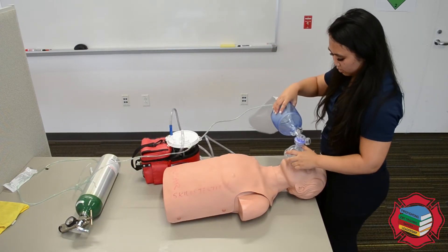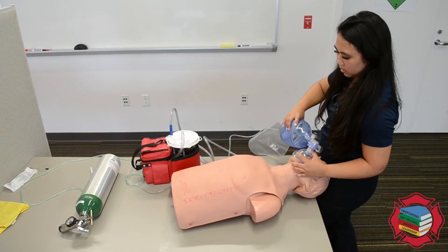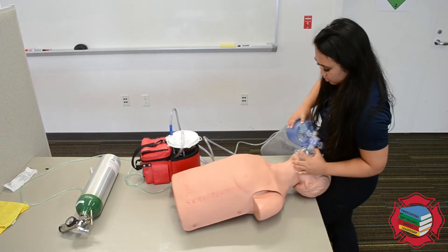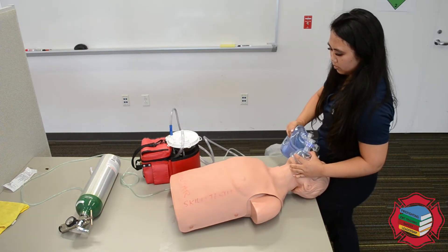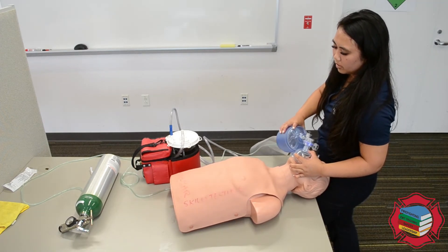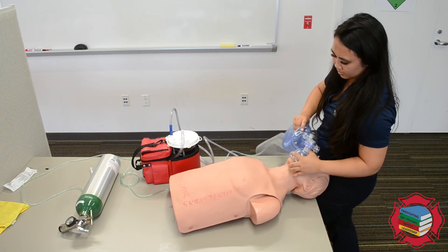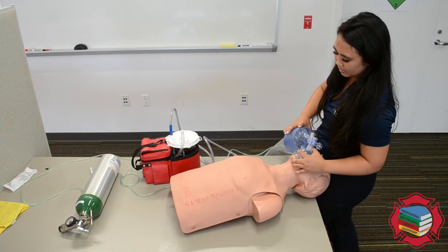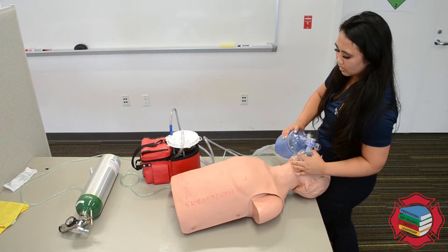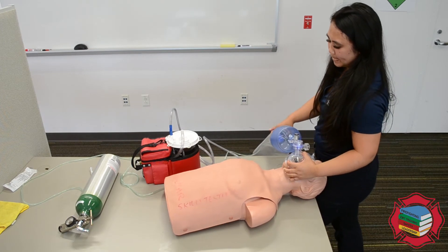I'm going to go ahead and start ventilating my patient. Ventilations are being properly performed without difficulty.